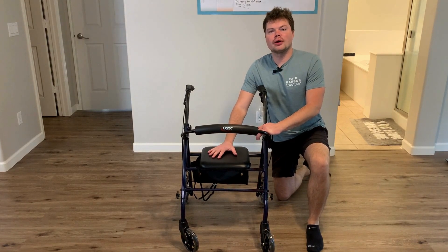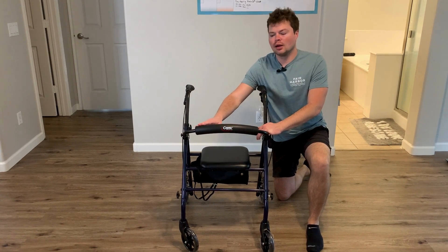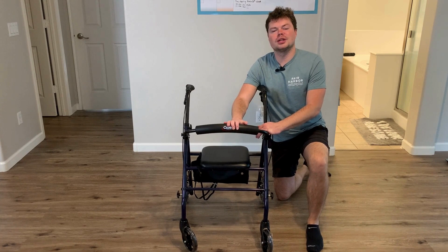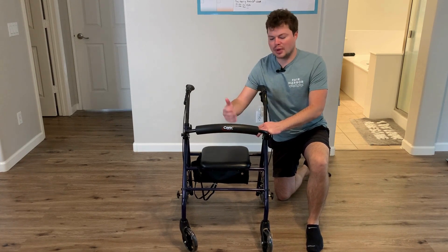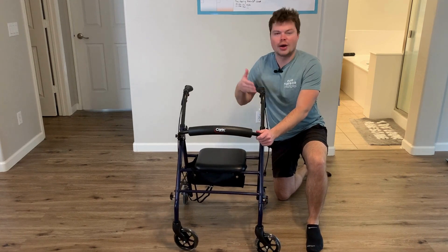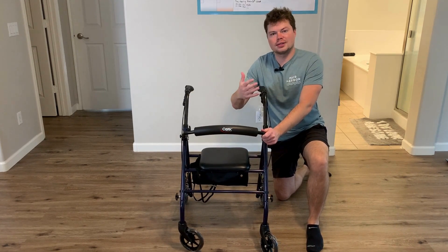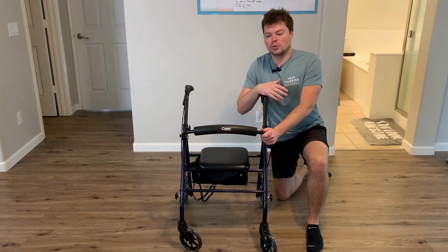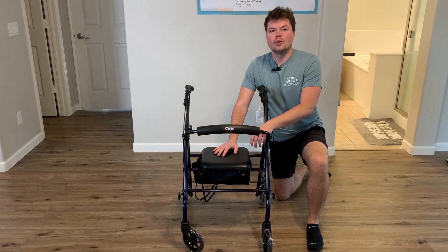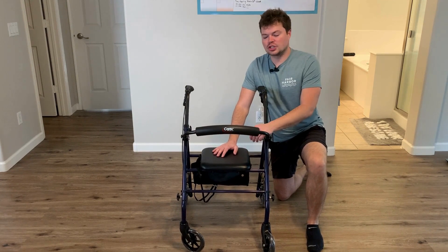So you're going to have the Carex rolling walker. I'm going to go over the top questions I was seeing: can you attach a basket or some type of storage device to this walker? The second question is what are the actual dimensions — the full width across, what does the seat measure out to, and how high do the handles go? And the third question was, can you fold this up easily to travel? So I'll answer all those questions and hopefully help you out with your purchase.